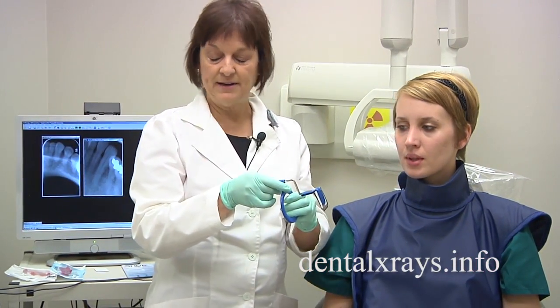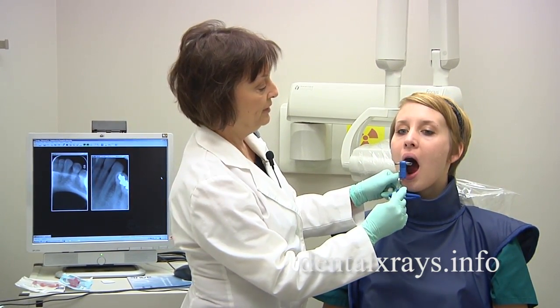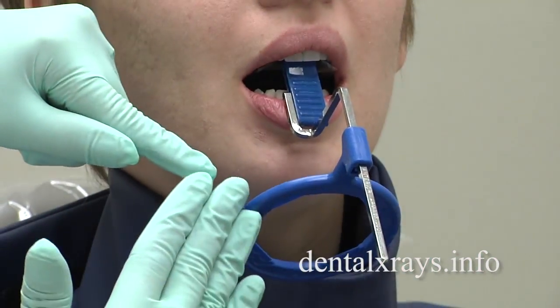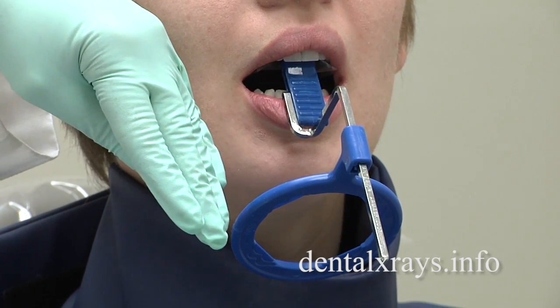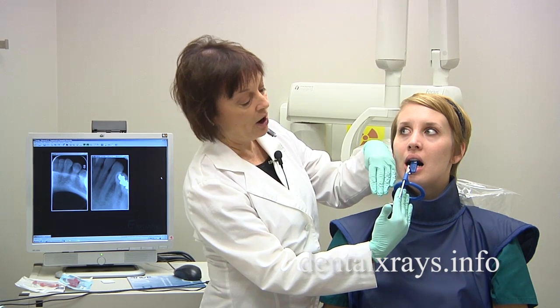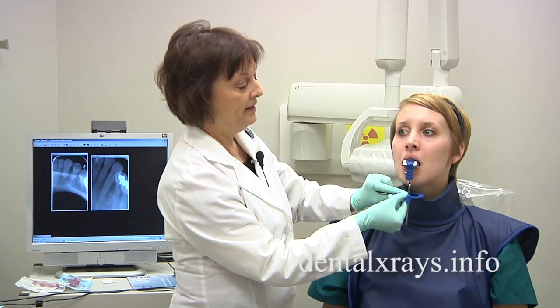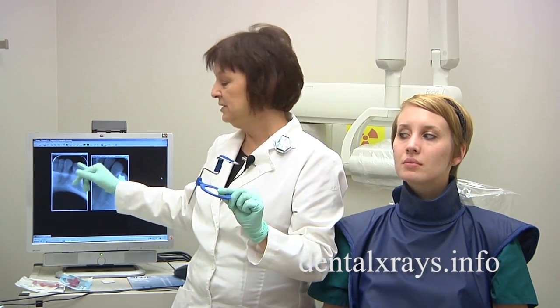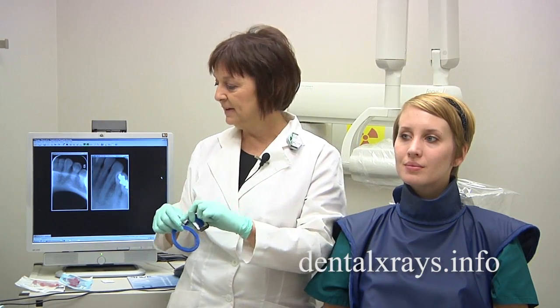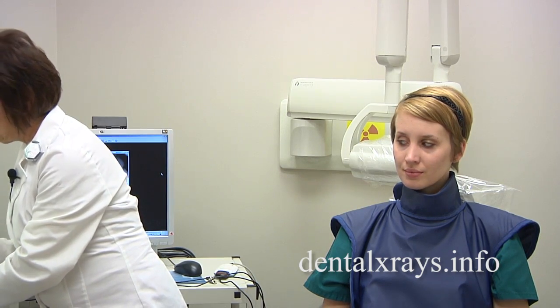I'll show you what happens to create foreshortening with this piece here. When you put it in without rolling it up and the patient gently closes, you can see the whole unit is actually tipped downward. By having an upward direction of the x-ray cone — coming from bottom up — it's actually projecting a very short image. So rolling it up before she bites will eliminate this problem. Ideally, it would have been great to have the size 1 film.